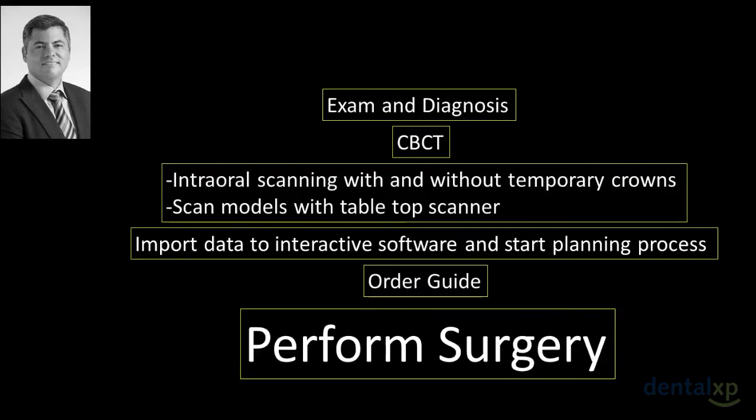Our protocol consists of doing an exam and a diagnosis. Then we do our cone beam CT, and as I said, there are different protocols for doing the cone beam CT imaging. For this specific patient, we decided to separate the teeth, but one of the new modifications to our protocols is that when we're optical scanning, we're not separating the teeth anymore, because it's going to give us a bite, and that bite is very important during the planning process. We used to separate the teeth because it was easier to separate the mandible and the maxilla, but we would not have that issue if we are working now with optical scanning.